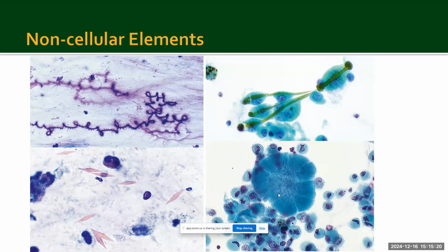The presence or absence of alveolar macrophages is what we are looking at for the assessment of adequacy. The more alveolar macrophages you see, the better you feel that you got a deep and good lower respiratory tract sample. And you will see more alveolar macrophages post lung transplant or if a patient is a chronic smoker.